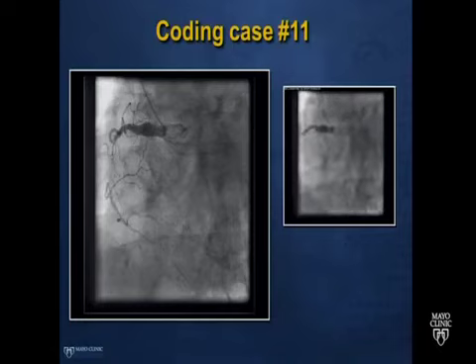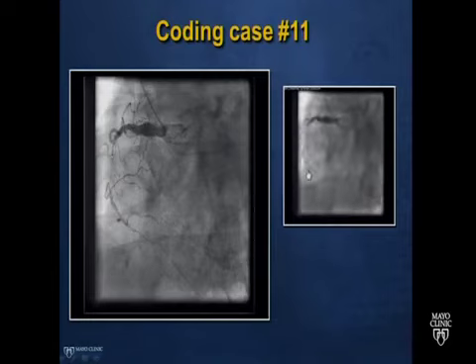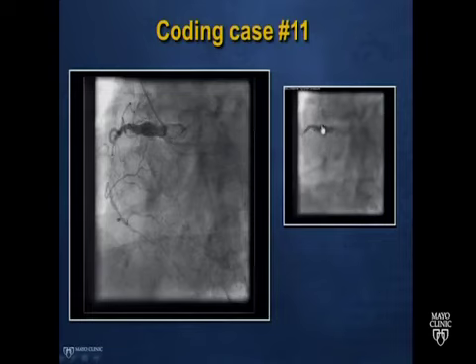So this is a picture of the patient's right coronary artery. This is an LAO view, vessels going to the patient's right. There's complete occlusion here with what we call bridging collaterals. So these are right-to-right collaterals, these little feeder branches here. We'd code complete occlusion, collaterals to the right. We'd also code aneurysm and ectasia in the proximal segment, given this finding here.